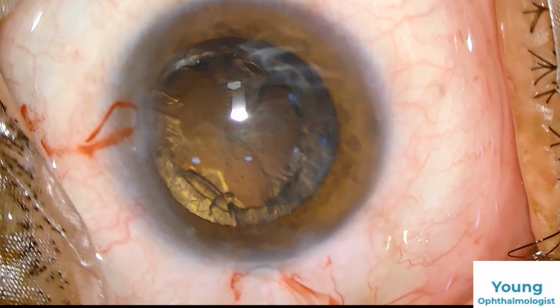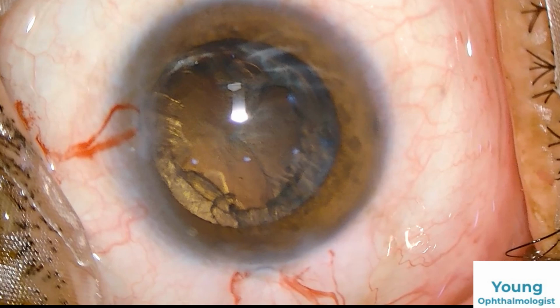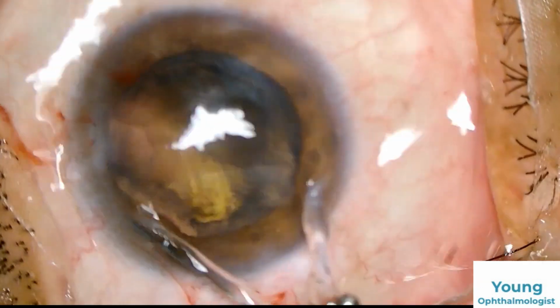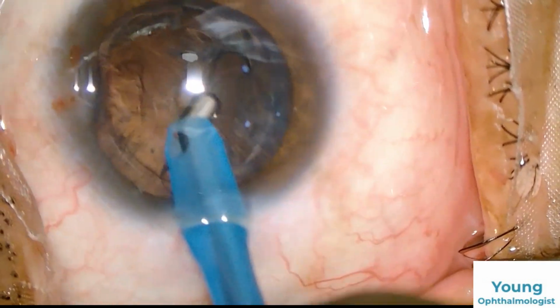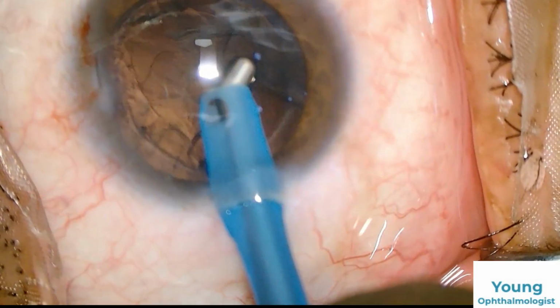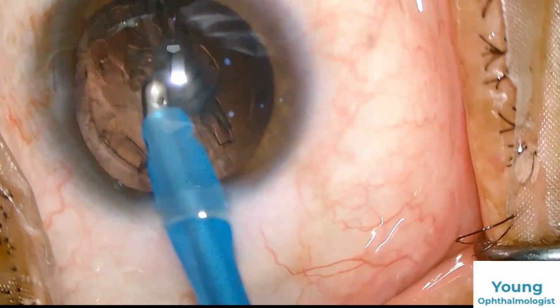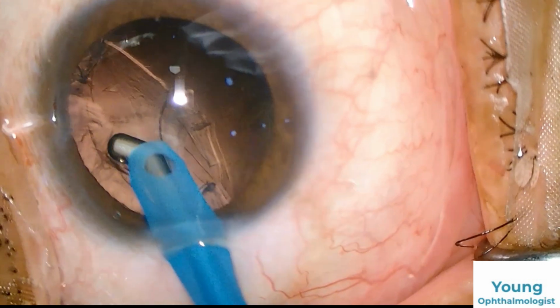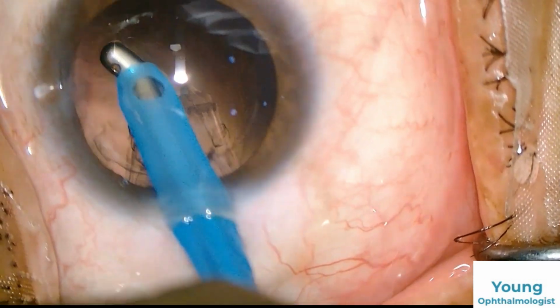Now it's time to do the cortical wash. Now we will be using our coaxial IA. Here the vacuum is almost 400 and flow rate is 40. My preference is coaxial because I'm using it from the start. Only in few cases where I need to retract the iris or in polar cataracts, I use bimanual. In general, I am comfortable with coaxial. You can use any, whichever you are comfortable with.